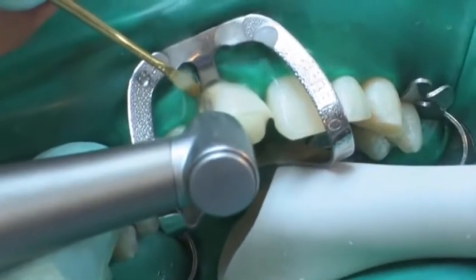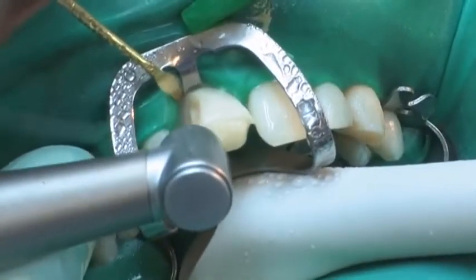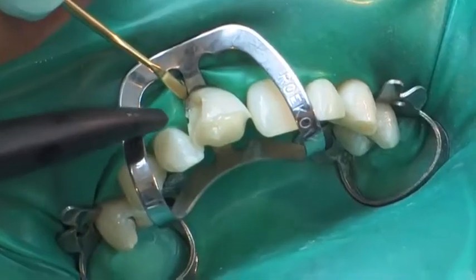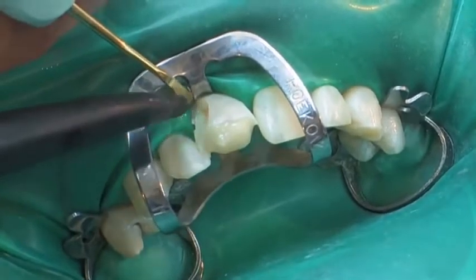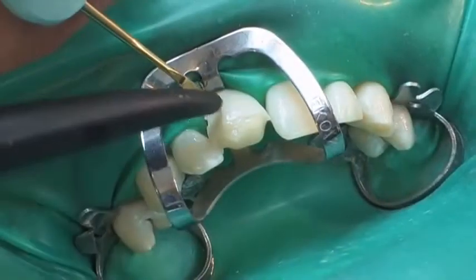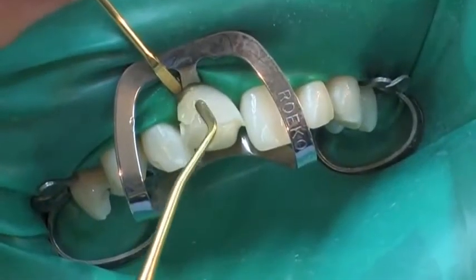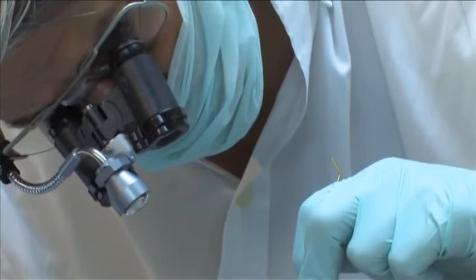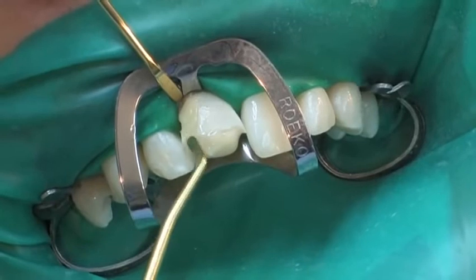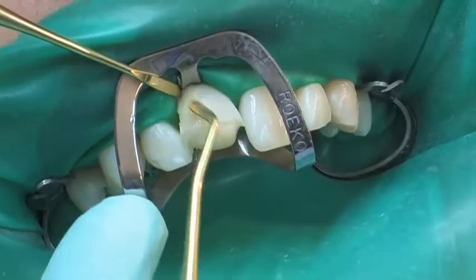The defect on the cervical margin is prepared using rotary instrumentation while preserving as much tooth structure as possible. A self-conditioning single bottle bond is ideally suited for placing small composite restorations in this manner. A small increment of composite is applied, sculpted, and polymerized.